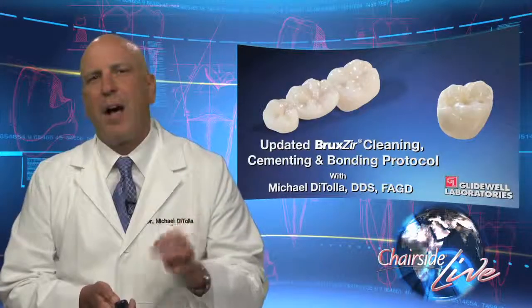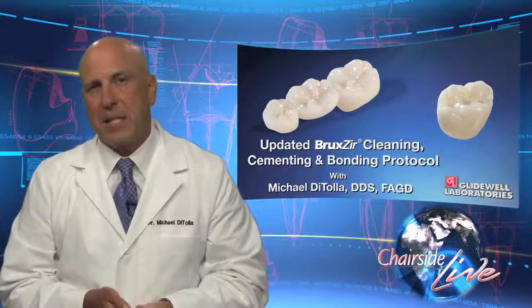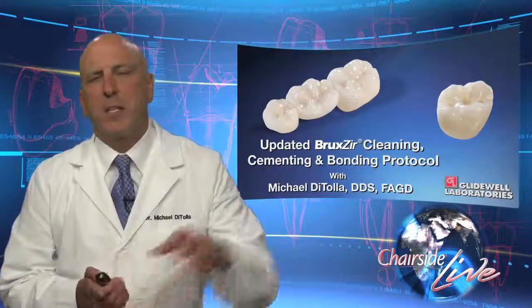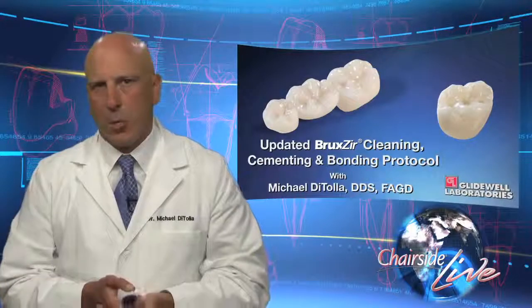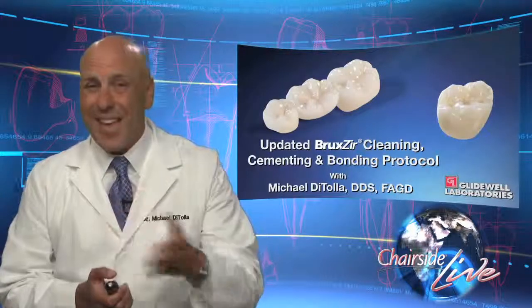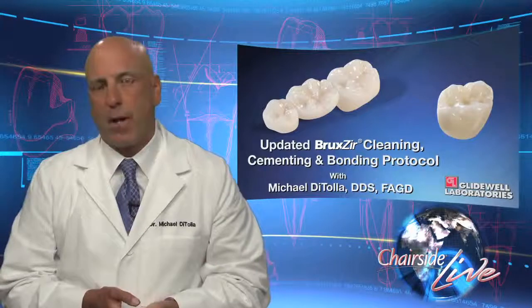Otherwise, Emax acts a lot like the regular all-ceramic materials of the past, where we're now going to paint a silane material like Monobond Plus from Ivoclar on the inside of the crown and then cement or bond that crown into place. So that's pretty simple and straightforward, with the one thing being, if you use a silicone fit checker to try the crown into place, you're going to want to get that out of the inside of the crown with hydrofluoric acid rather than phosphoric acid.